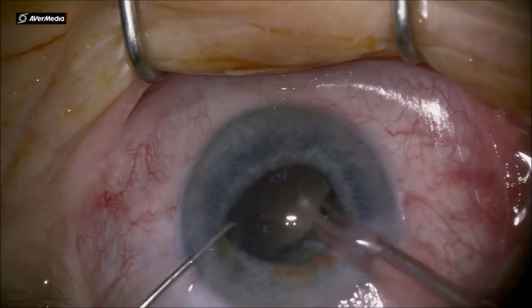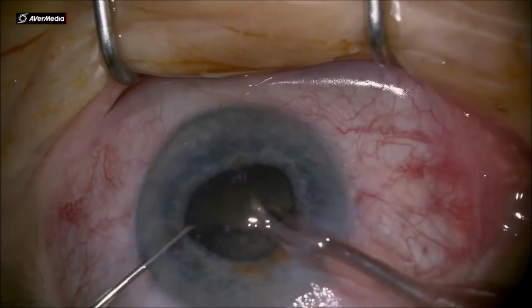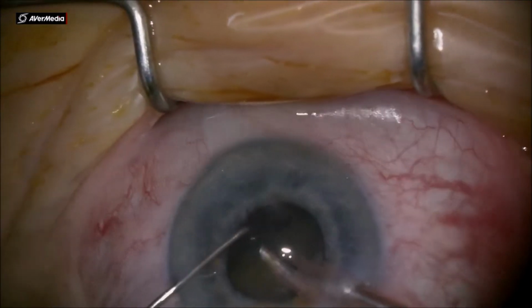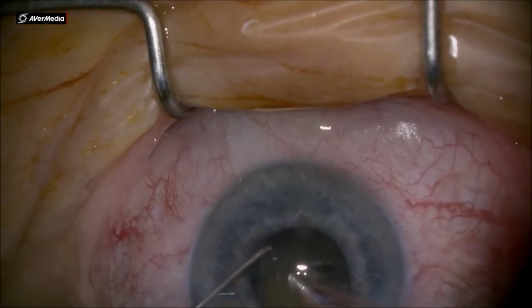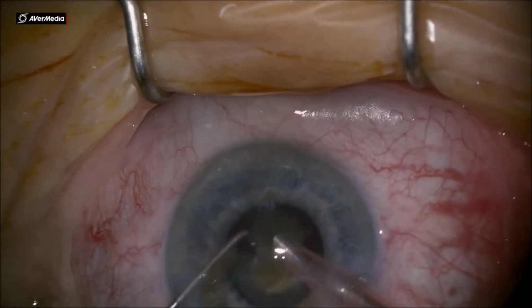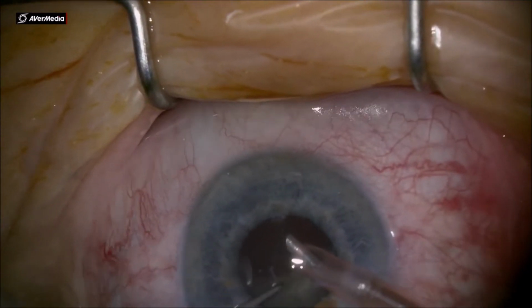And then it's pretty straightforward, the phacoemulsification, as long as we keep the nucleus in the phaco needle in the middle of the pupil, and then use the chopper to feed the phaco tip with the pieces and do a lot of chopping, will speed up the phacoemulsification process.